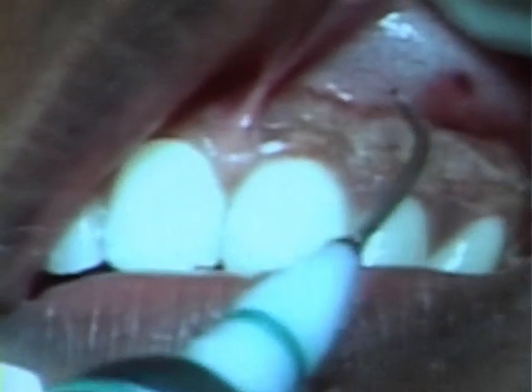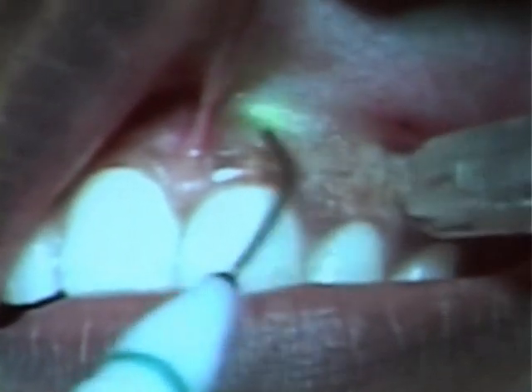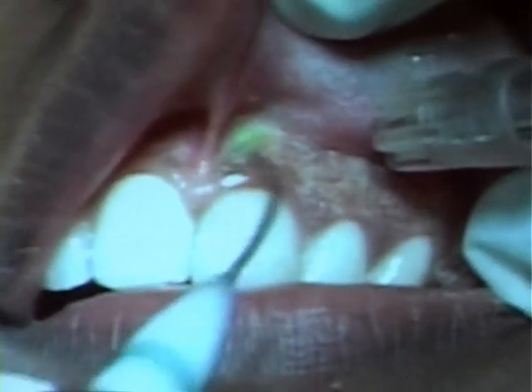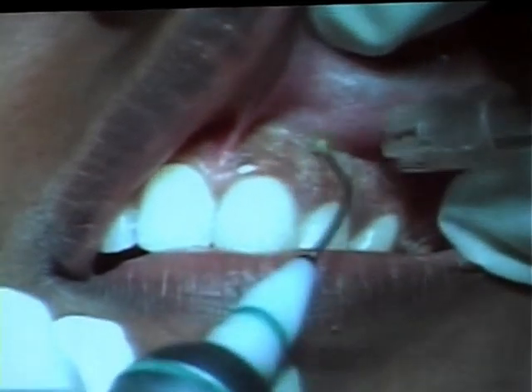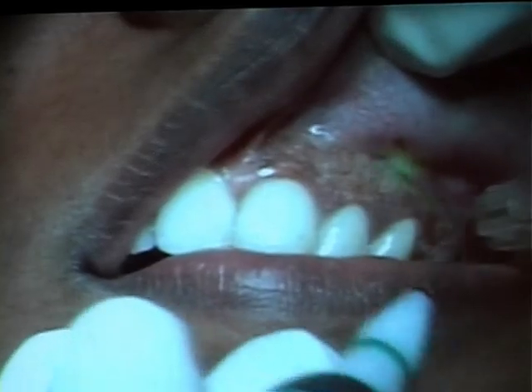This is the diode laser. You use a diode for hair removal as well. The skin has 3 or 4 different types of lasers that you can use. You can use the diode, you can use the erbium for skin resurfacing, you can also use the Nd:YAG. So you have 3 different uses for different purposes. The erbium is a very good laser for skin resurfacing.